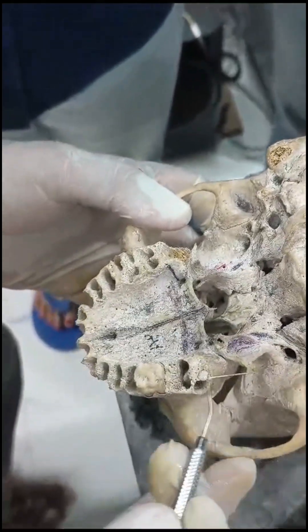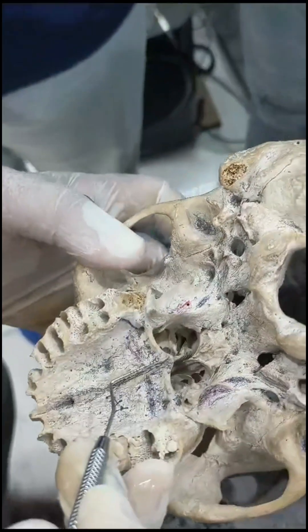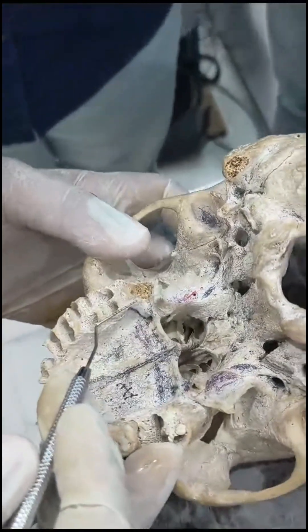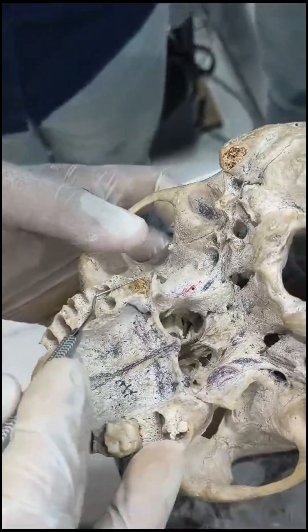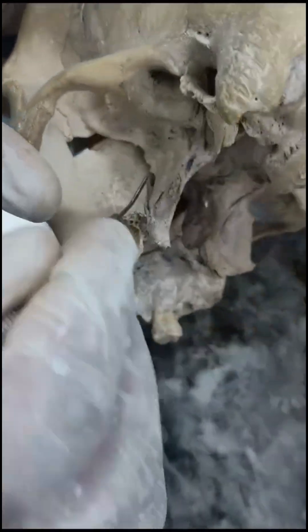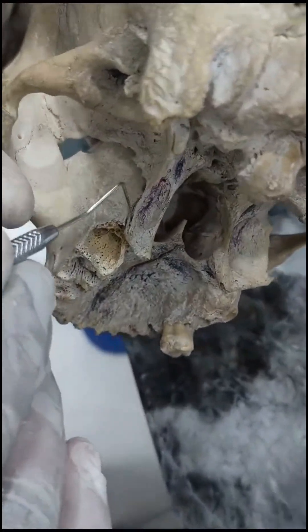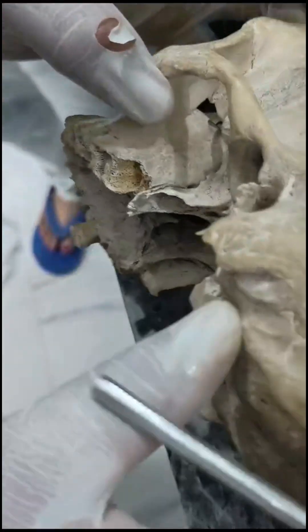Here also we are missing out. So what is the technique? The technique is to angulate the drill in such a way that our drill hits the pterygoid plate. This is the fusion zone, as you can see — there is a depression, the fusion zone is there.